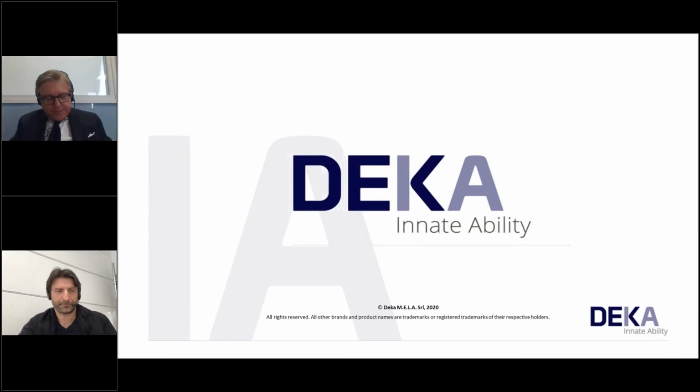Thank you for the question, because I can answer by saying that the fractional CO2 is the strategy. In the old SmartXide DOT we have only SP. With the new SmartXide Punto, Touch and Tetra, we would use DP, but even SP is important. SP pulse.